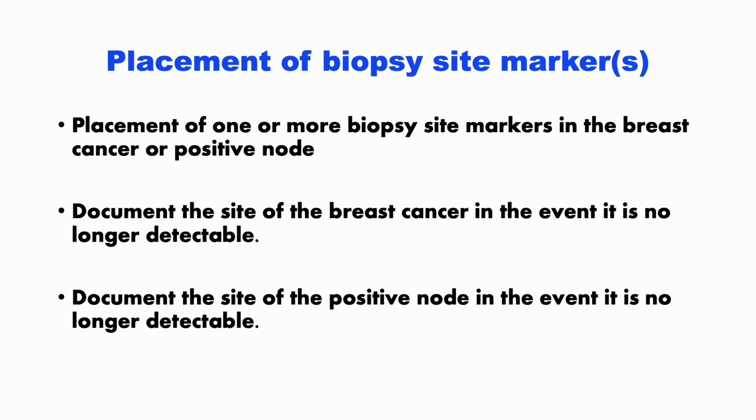Whereas a single marker might be sufficient to document the site of smaller stage 2 tumors, larger tumors would benefit from placement of multiple biopsy site markers to outline the margins of the tumor. In addition, placement of a biopsy site marker at the time of lymph node biopsy will facilitate its identification if the lymph node appearance returns to normal after chemotherapy or after anti-HER2 therapy.